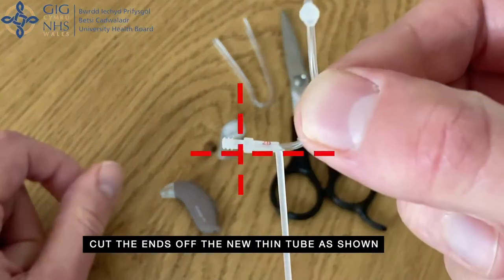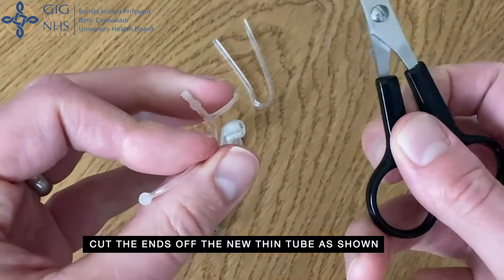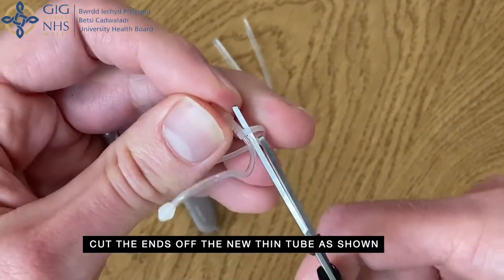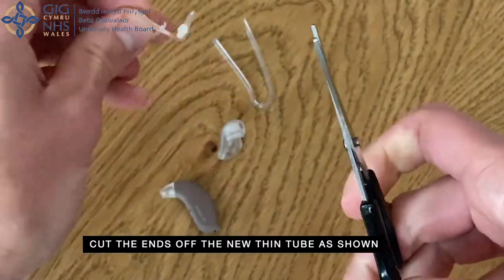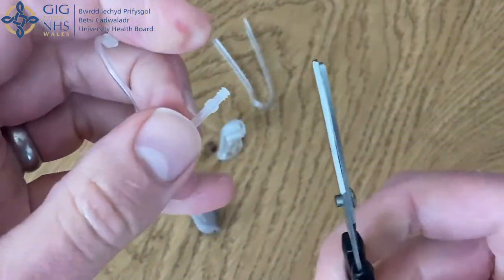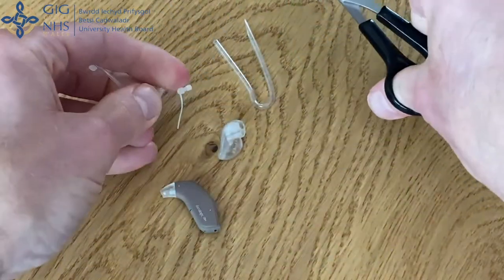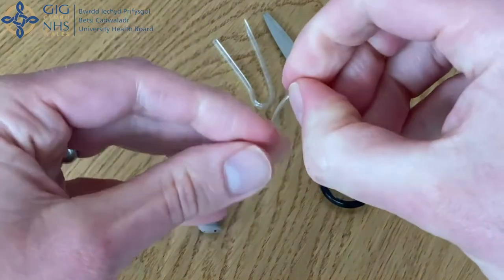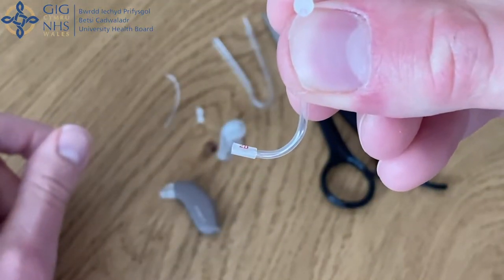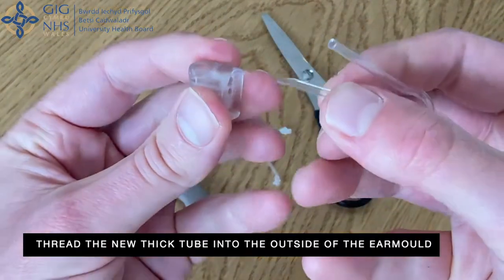Use scissors to cut the ends off the new tube as shown. Thread the new thick tube into the outside of the ear mould.